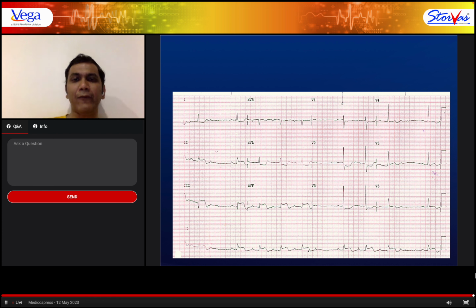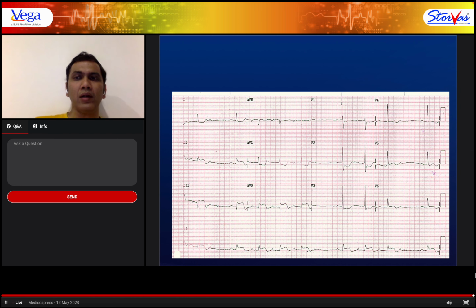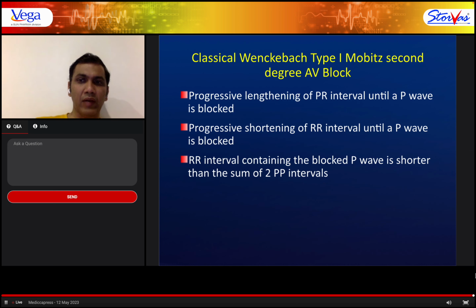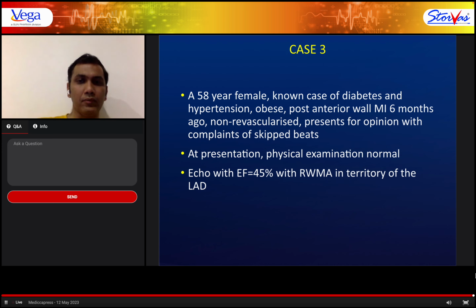So in this patient, definitely no need for pacing, but you want urgent revascularization depending on what the presentation of the patient is. It is very common for inferior wall myocardial infarctions to have this kind of abnormal AV block. It does not require a pacemaker unless this rhythm is persistent beyond 21 days. So the question for this particular ECG would have been, is a pacemaker needed? Answer would be a definite no.